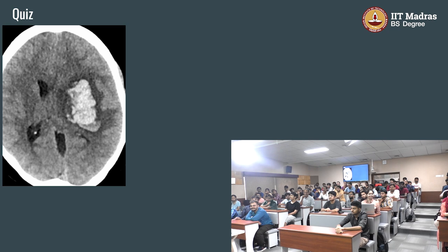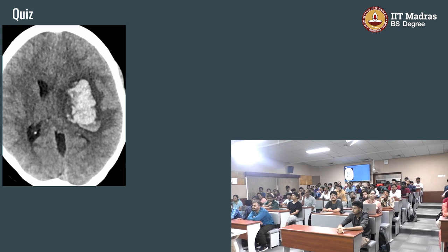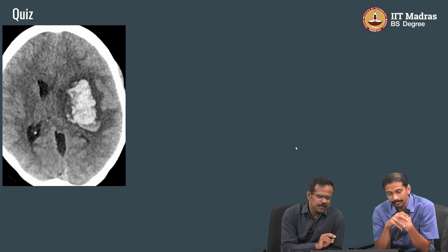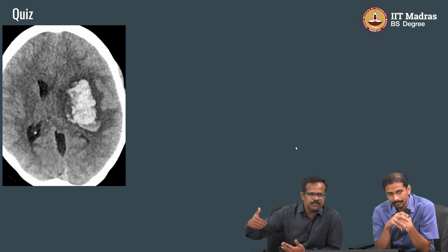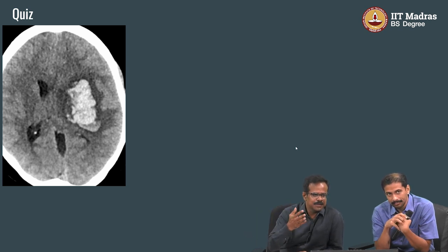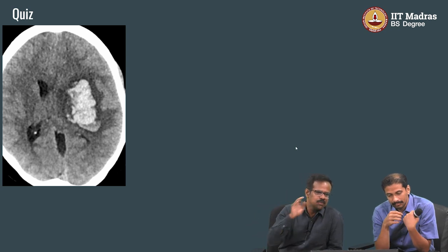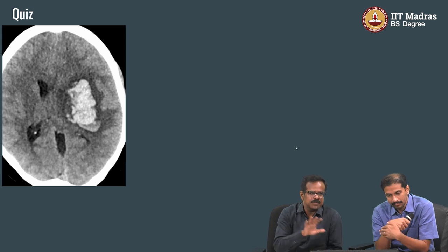He is a very senior radiologist. It is a no brainer. It is a bleed within the brain. How does he make the diagnosis within a fraction of a second? I will show how many UNet or ResNet architectures were developed to make this diagnosis, and finally the machine is successful in separating a hemorrhage. But what happened inside his brain within a fraction of a second involves a series of things: his eyes have seen it, it has gone in, it has recollected with his memory and known knowledge. He did his MBBS first, how the brain looks, how a CT scan is formed, how the CT scan will show the bleed inside the brain. These processes are there.